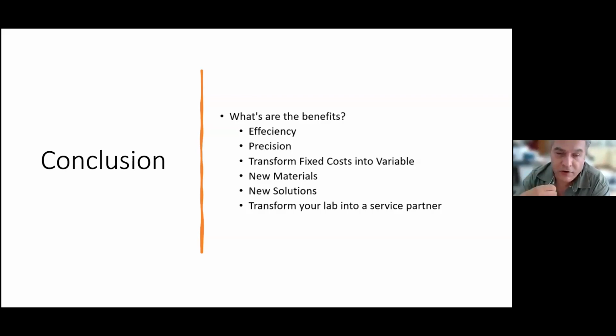Or if you don't have the design option to do a chrome denture, you just scan the model, you send it out to someone who can do this for you, and a company prints the metal, you get the fixed chrome ready-made back. For example, in Germany, you get a chrome denture ready for around 80 euros. You just send it out, you have it next day. And you don't get this price handmade, no way.